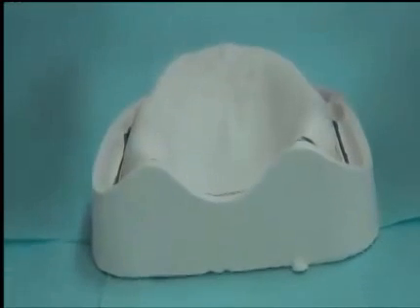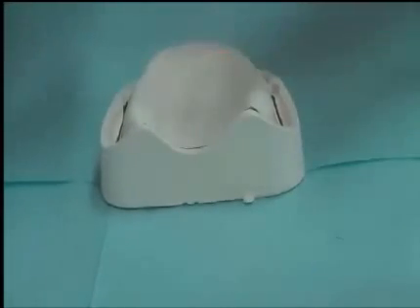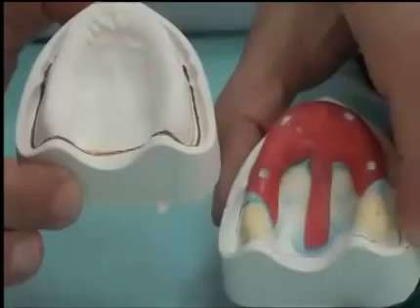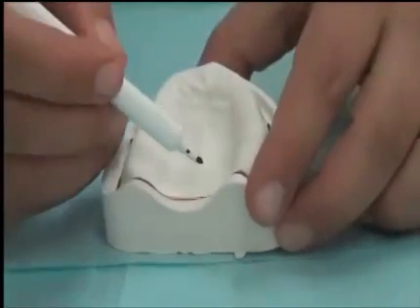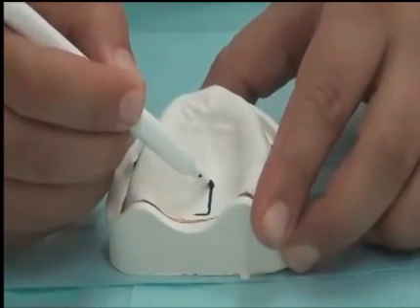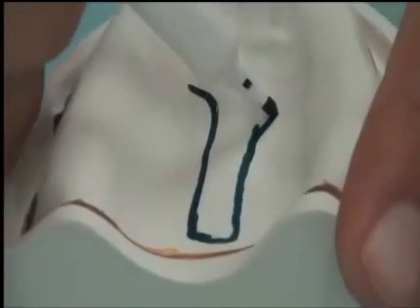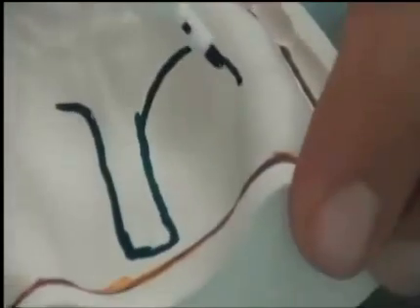The third step is we draw the outline of the spacer. And here we're following the partial spacer shape. So we're going to draw the line over. We're going to add the lines over the areas that we should be relieving. So mid-palatine suture, just revising them. The rugae area, the crest of the ridge, up to the tuberosity.